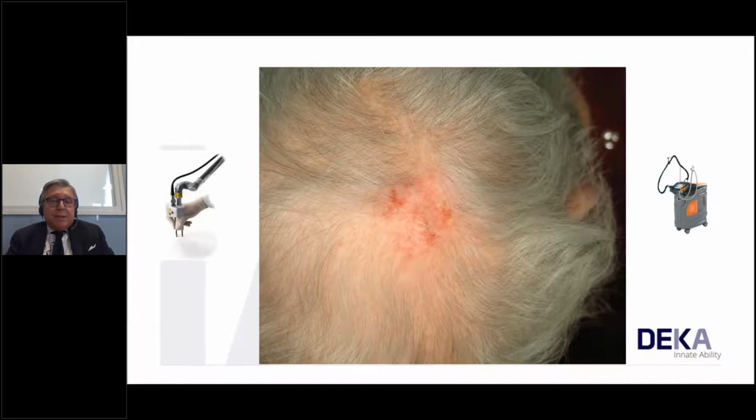The fractional CO2 is capable of renovating the skin even at the molecular level, because sometimes we treat the décolleté and the face with the fractional, normally with the purpose of improving the cosmetic appearance. We have even a sort of rejuvenation at the molecular level. Regarding the percentage of basal cell carcinoma that we usually have in the skin before the treatment, we don't see any recurrence after the fractional. So maybe we have a sort of rejuvenation at the molecular level.